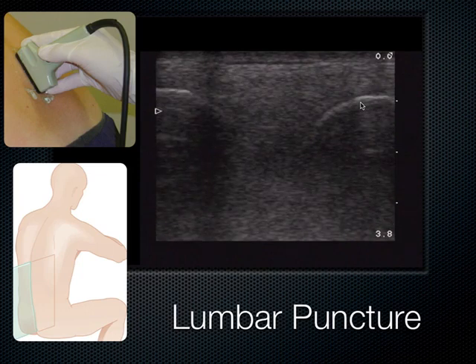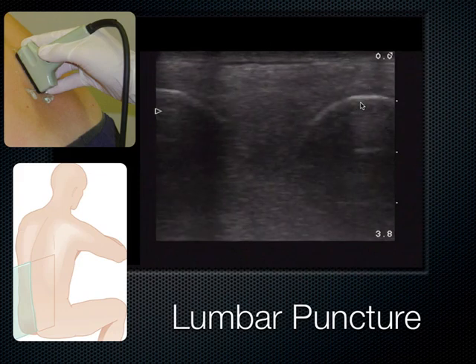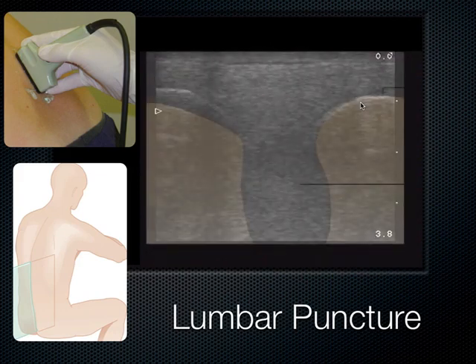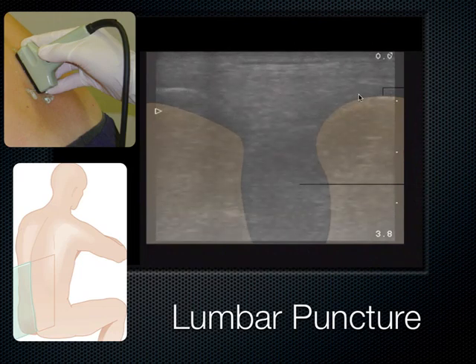And my fellow from last year, Connie Chan, who many of you obviously know and remember, she created a nice video on how to do this. And these are the vertebral spinous processes seen here.